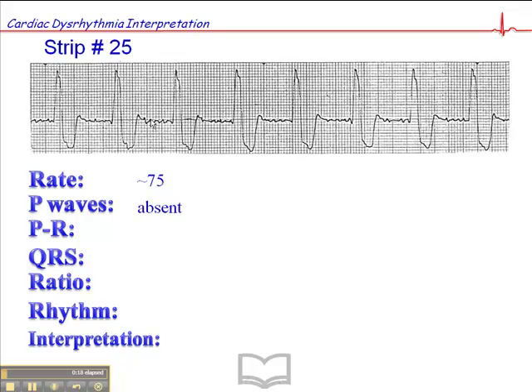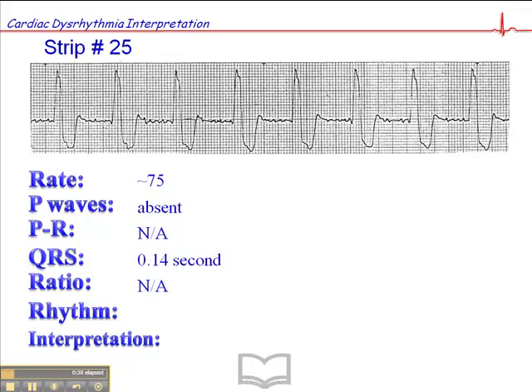What we have is a lot of bumps along the baseline, but none of them are consistent in morphology, so we're not entirely sure what that is. If there are no discernible P waves, clearly there can't be a PR interval, so that's not applicable. The QRS is wide — about 0.14 seconds — and the ratio would not be applicable if there are no discernible P waves.